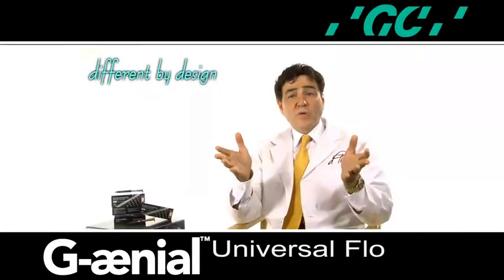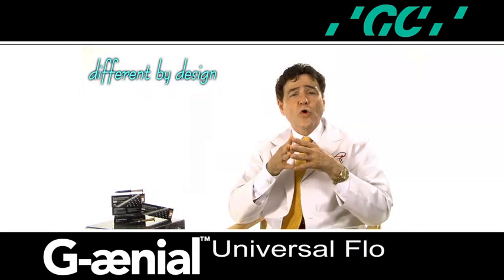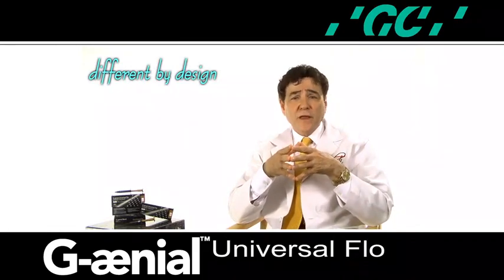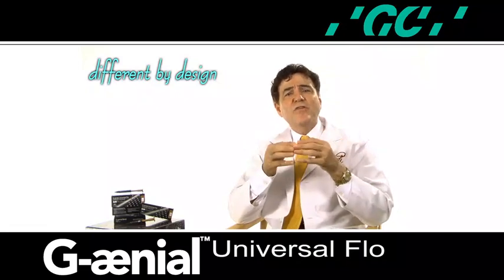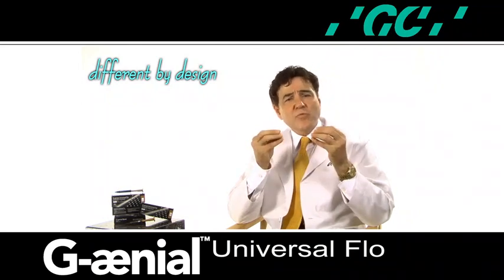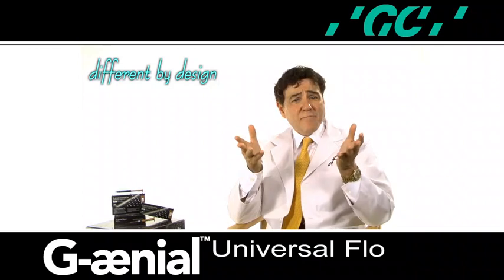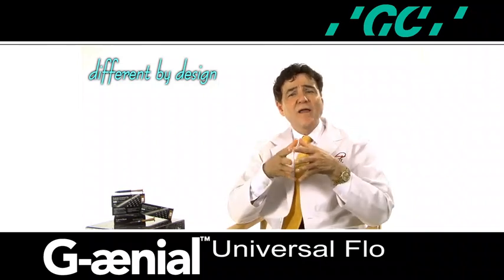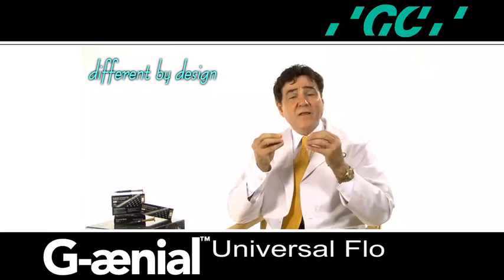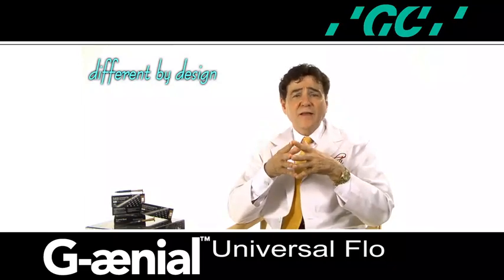The flowable composite resin mock-up is an excellent tool for communicating interdisciplinary information to other members of the restorative team, while also increasing a patient's understanding and education of the planned clinical procedure. These composite prototypes allow the patient and the restorative team to establish parameters for size, shape, function, lip profile, incisal edge position, and gingival orientation, while eliminating confusion and misunderstanding.